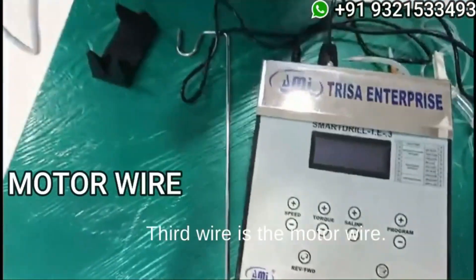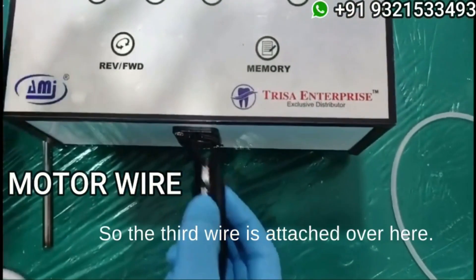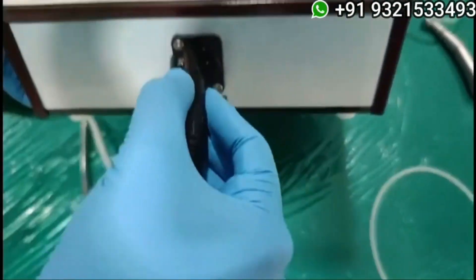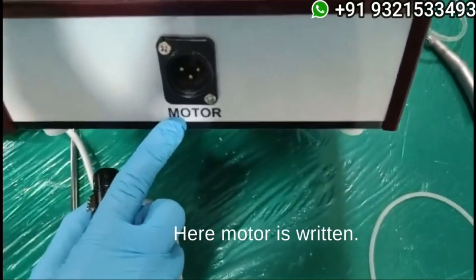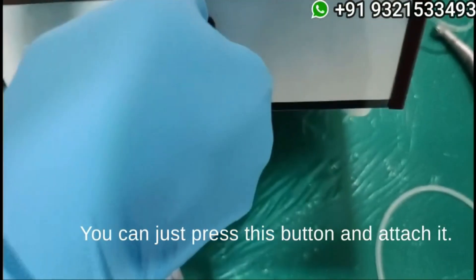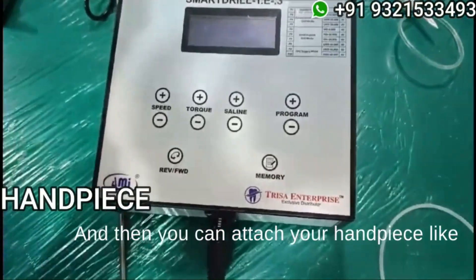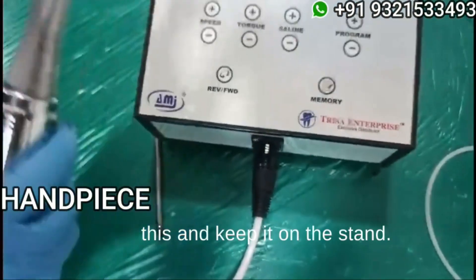The third wire is the motor wire. The third wire is attached over here where 'motor' is written. You can just press this button and attach it, and then you can attach your handpiece like this and keep it on the stand.